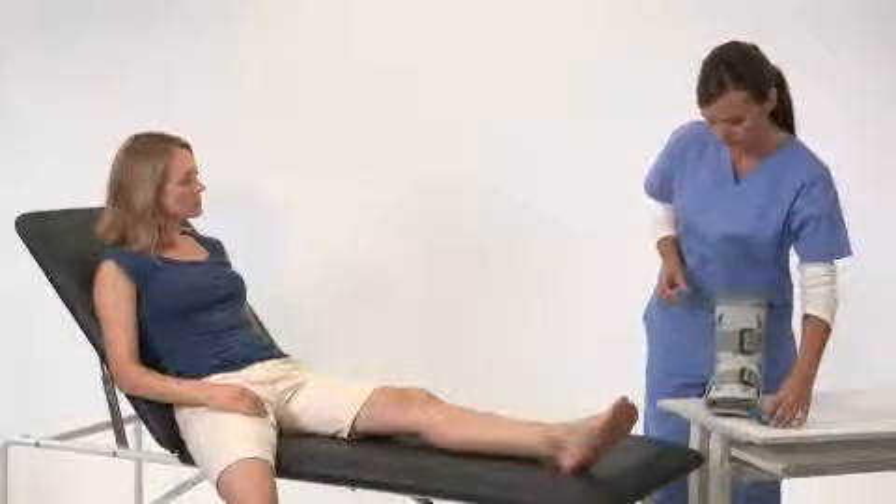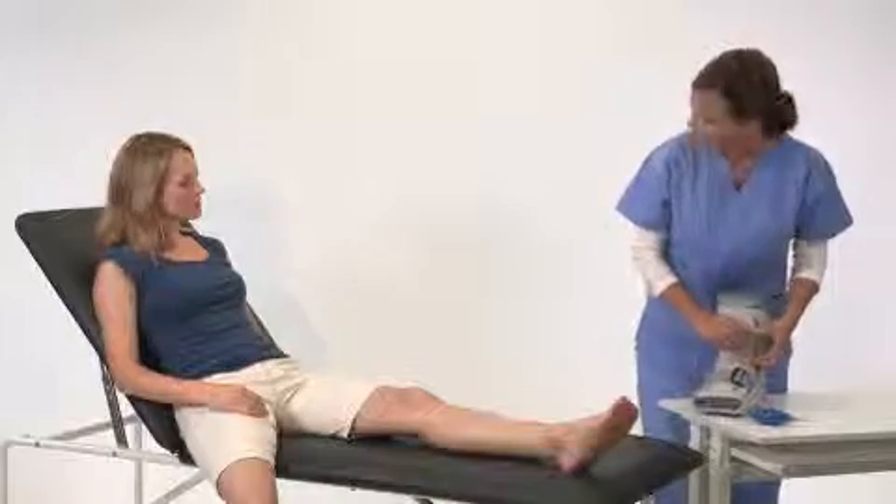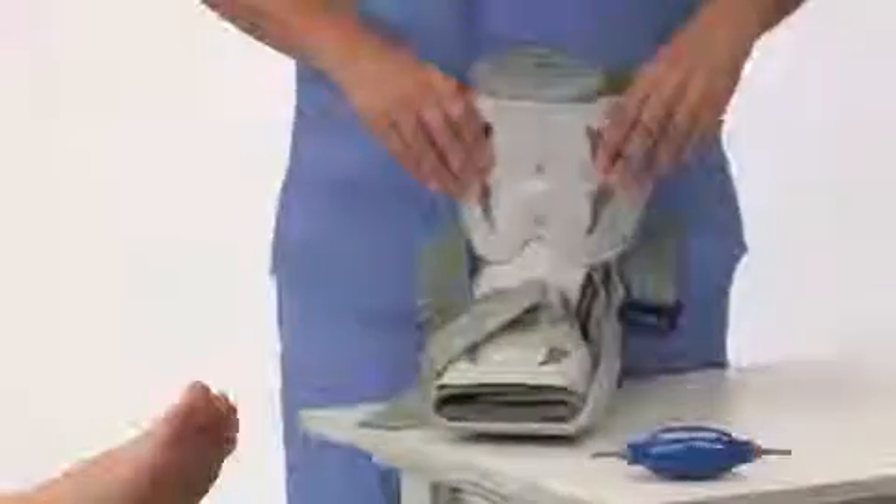Start by preparing the brace. First, unfasten the straps, then remove the front panel and open the liner.